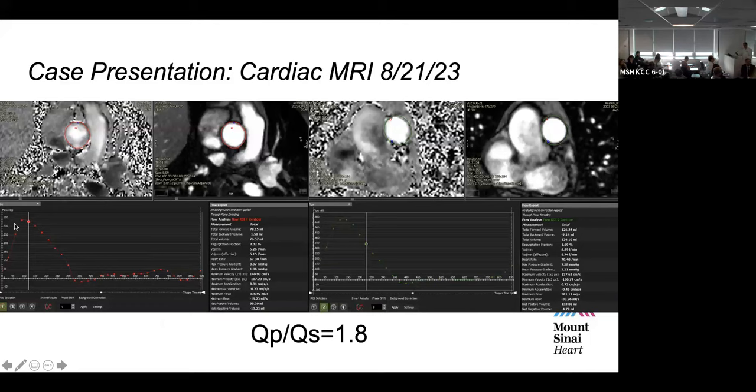So the question is why, for a cardiomyopathy study, do you have a 3D? We have the 3D CT later, so we'll be able to see the defect very well. Not from the MRI? No, it is possible, we do that, but it shows a lot better with the CT. So I wanted to save that for later.